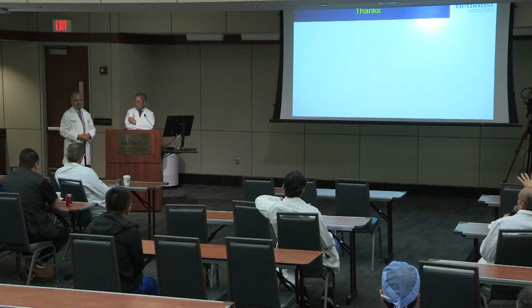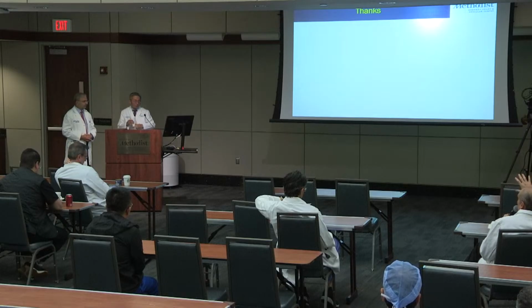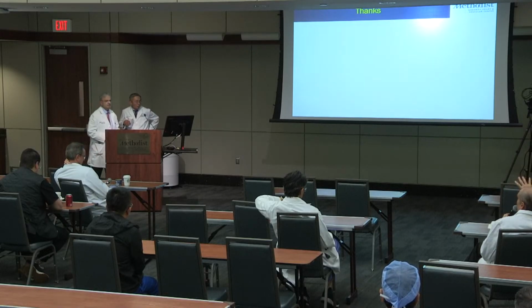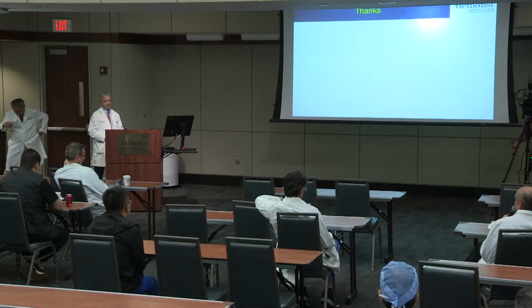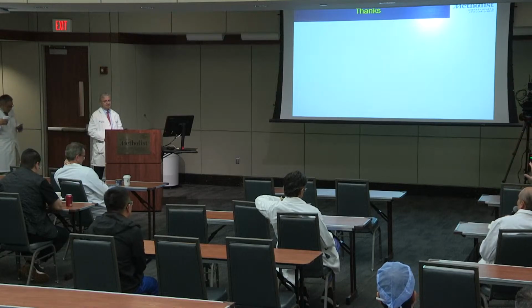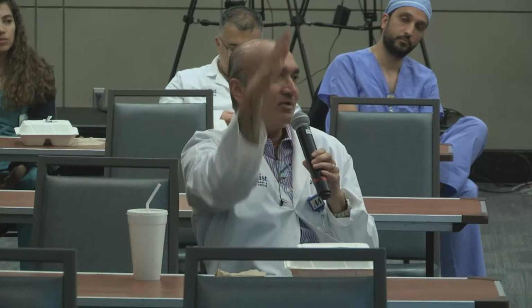Bill, a question for you. I saw in the ASE prosthetic valve guidelines, when you're talking about grading the severity of prosthetic aortic regurgitation, you use the same volume threshold. So 60 cc's would be severe. My question would be, would you modulate that? We know for native valves, 60 cc's may be severe AI. Maybe that's debatable even. But what you're dealing with here is probably more of an acute AI, because most of these are aortic stenosis ventricles that all of a sudden develop regurgitation.